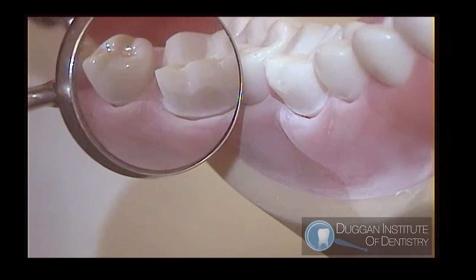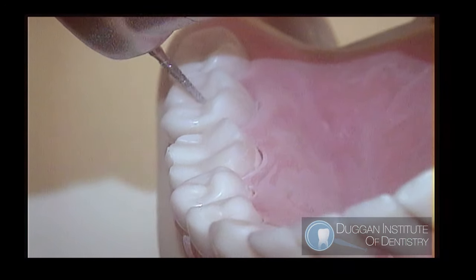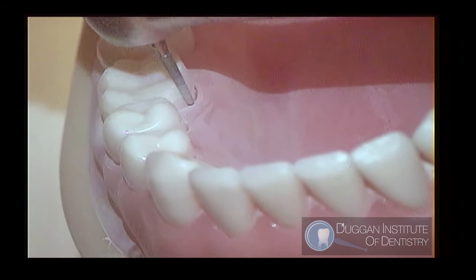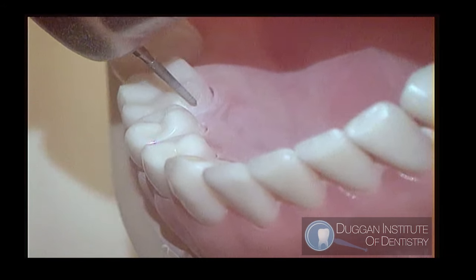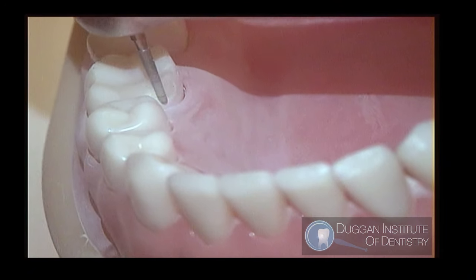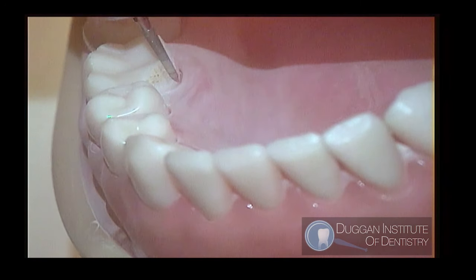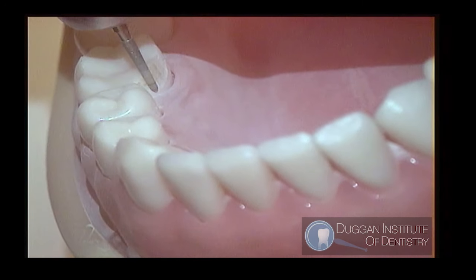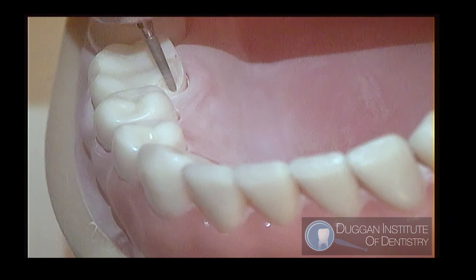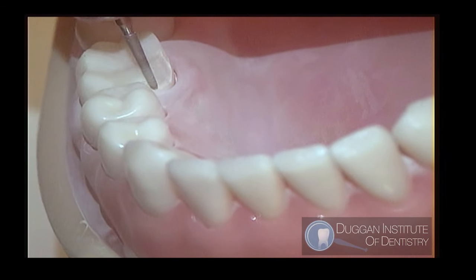Lingual axial reduction. In order to reduce the axial surface, we look along the wall. This allows us to see the taper, the tip of the burr, and along the wall. The burr I'm using is a medium-sized chamfer 878K .014 diamond. Axial reduction is 1 mm to 1.2 mm with a 0.5 mm chamfer. Keep the gingival margin a little more than a 0.5 mm above the gingiva.